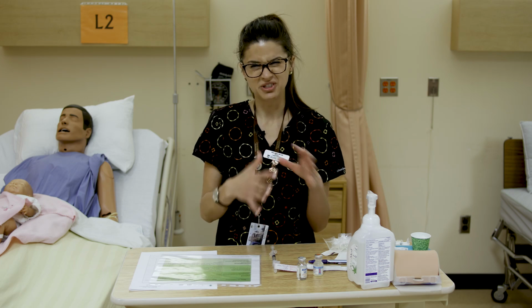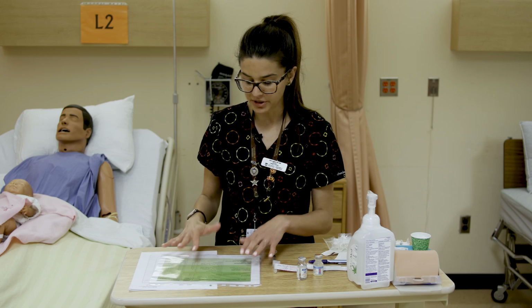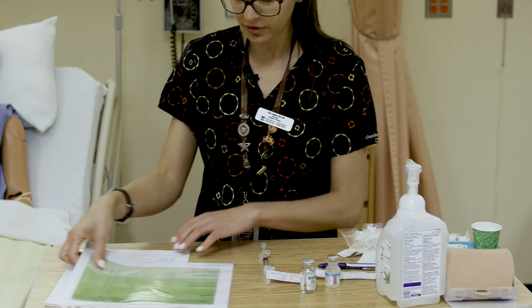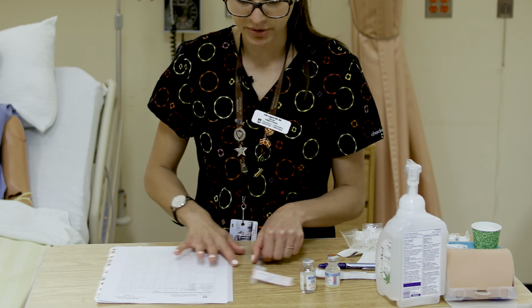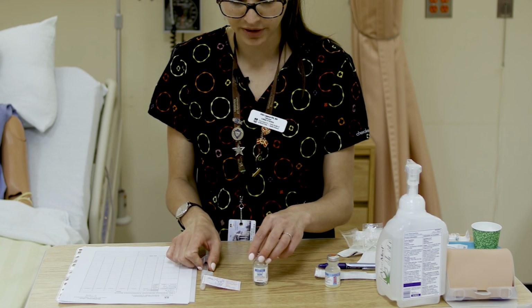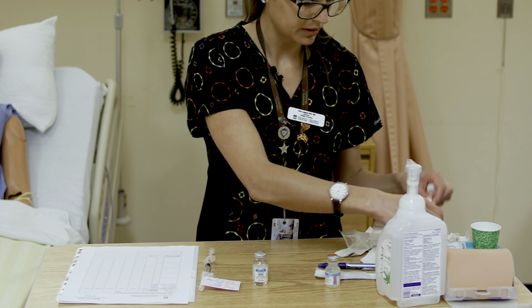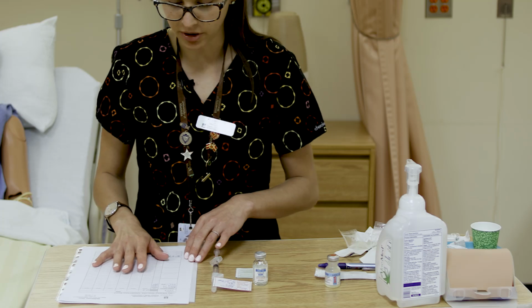Some dictate that you should stay under 1 or stay up to 1, but it just depends on the site's policy, so you'd want to check that. Before we leave our med room, we'll perform our second check. We've left the medication syringe out, and we've left the vial that we took it from out. We'll prepare ourselves with a cotton ball and an alcohol swab.